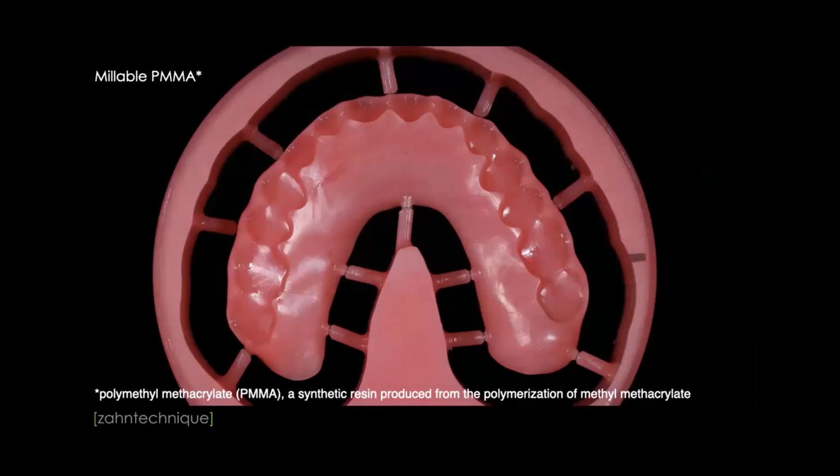So the strength of the millable PMMA is great. It's much stronger than the printable resin. And aesthetically, the pucks that they have are very aesthetically pleasing, much more than they used to be. So how is it actually manufactured? These pucks, it's cool.